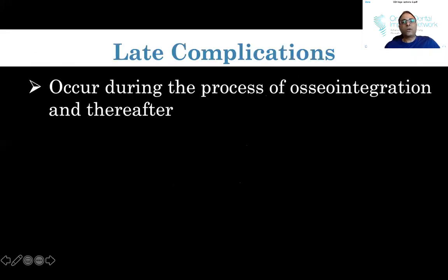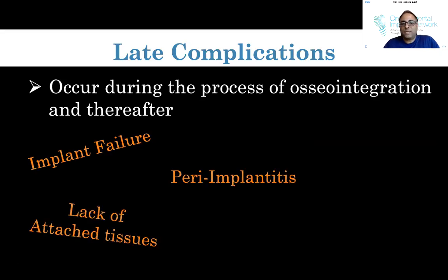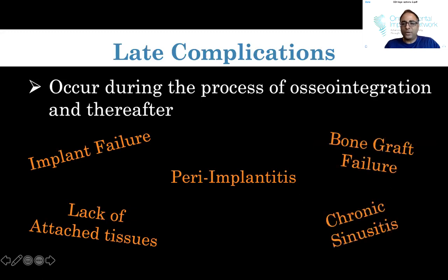Late complications I'll touch base on very briefly, but they occur during the process of osseointegration and thereafter. Generally you're looking at things like implant failure, peri-implantitis, lack of attached tissues, bone graft failure, and chronic sinusitis.